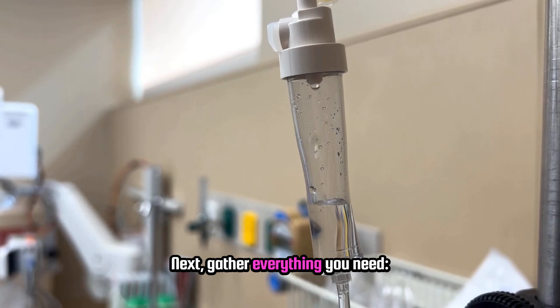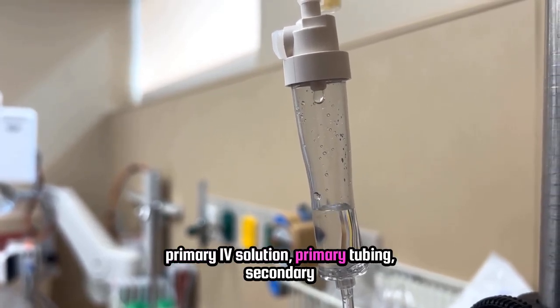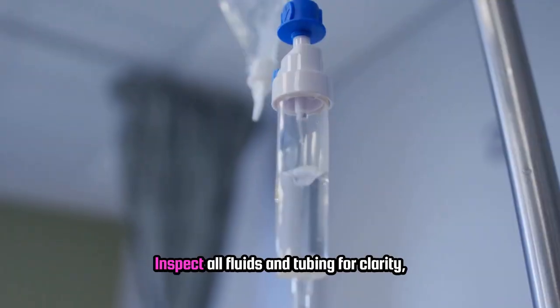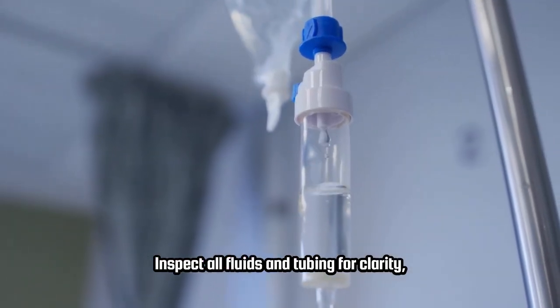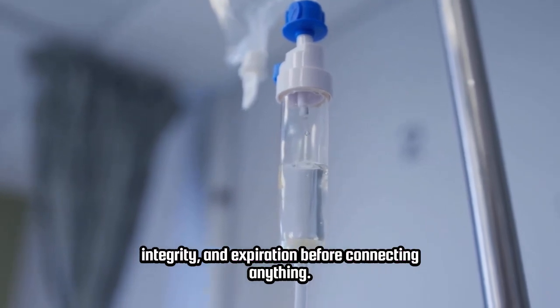Next, gather everything you need: primary IV solution, primary tubing, secondary medication bag, and your smart pump. Inspect all fluids and tubing for clarity, integrity, and expiration before connecting anything.